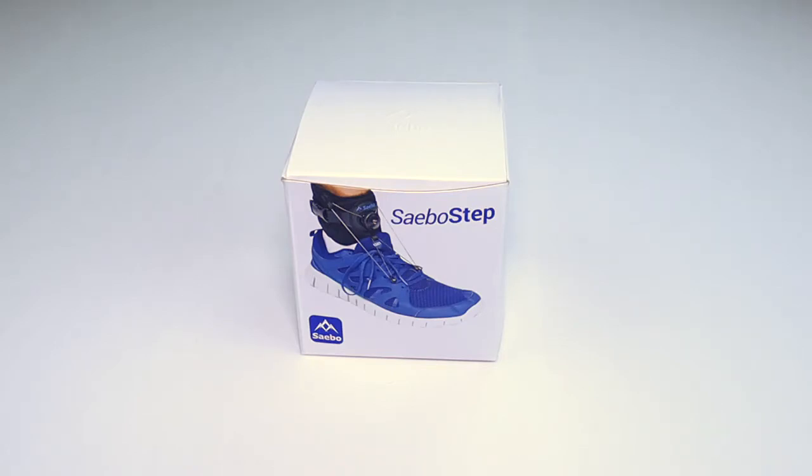Too many times we've seen people wearing an AFO that doesn't fit, causes sores or irritation, and holds someone back from progressing in their recovery. Now, with the SaeboStep, you have options.